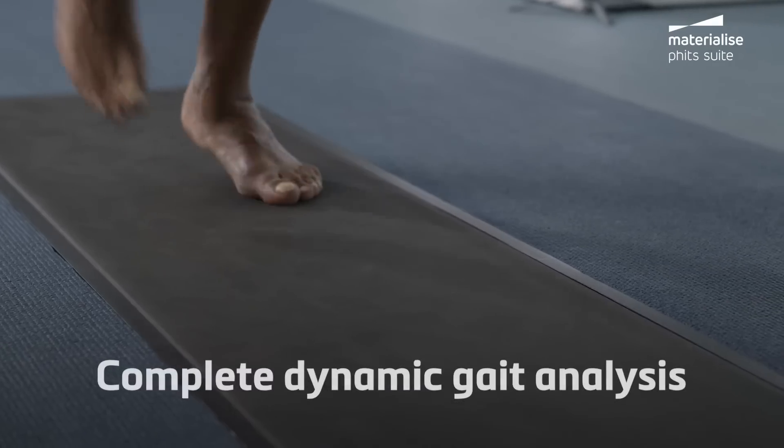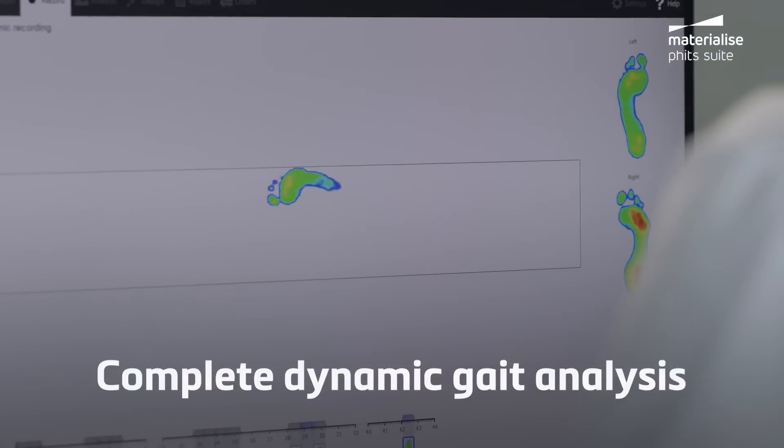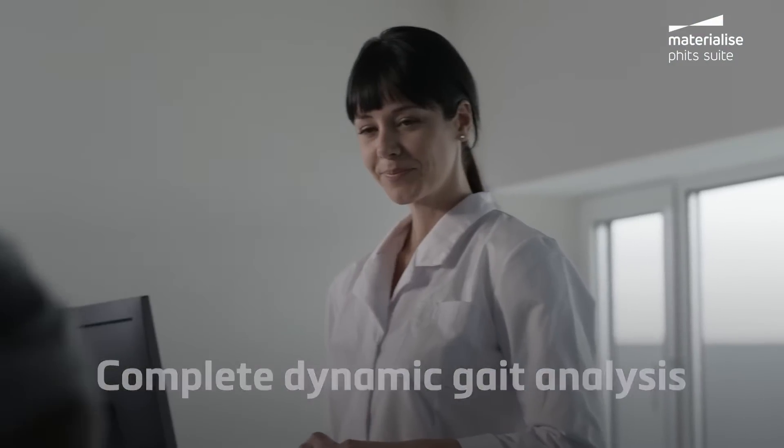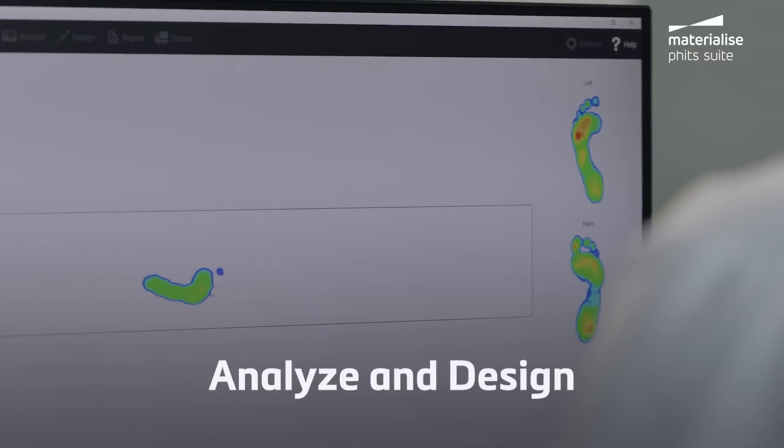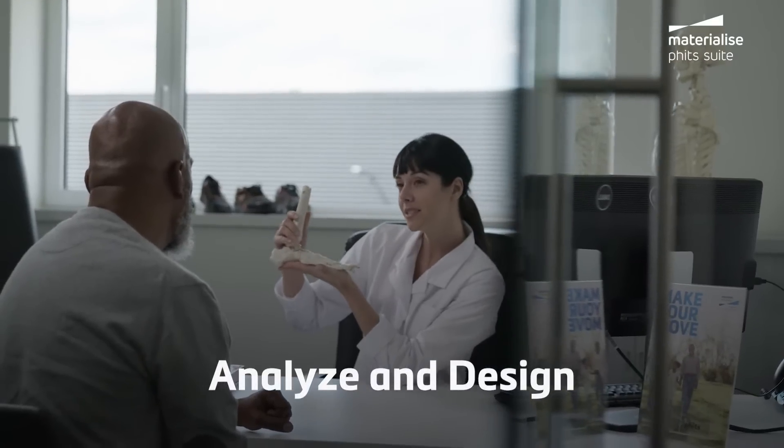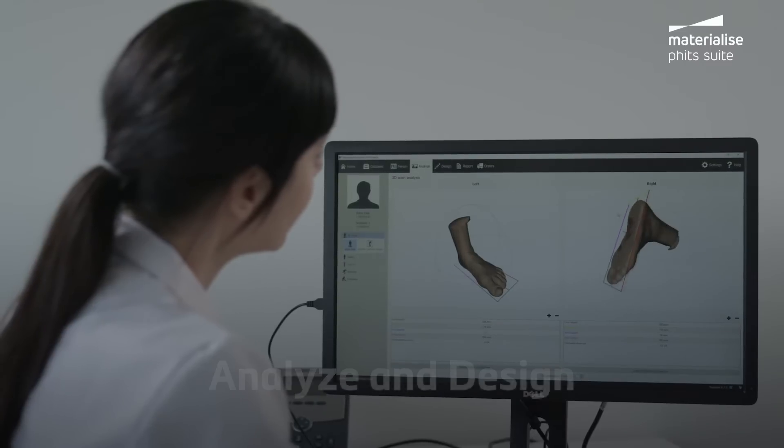Generate an in-depth 3D scan of your patient's foot and ankle using a scanner you choose. Combine it with foot scan pressure plates for a complete dynamic gait analysis.